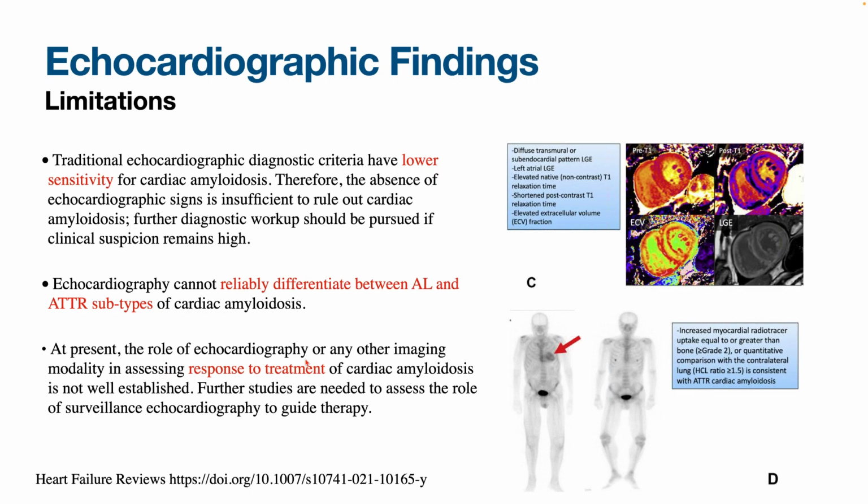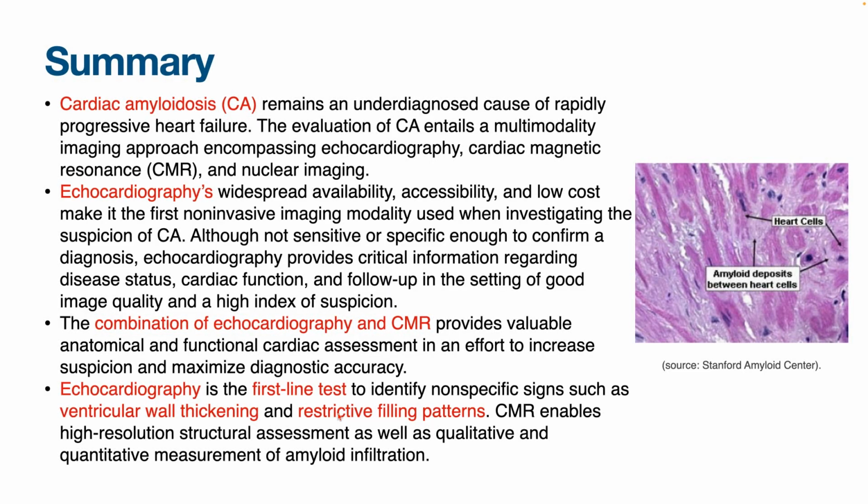Again, at present, the role of echo or other imaging modality in assessing response to treatment of cardiac amyloid is still not so well established. So again, this is the area that we need to focus on looking for.